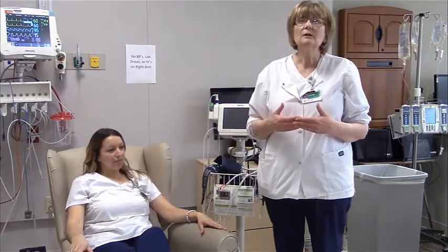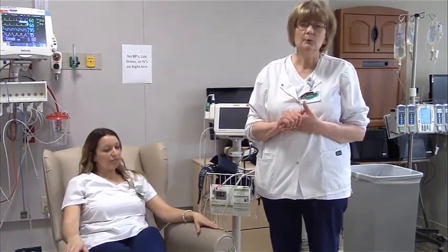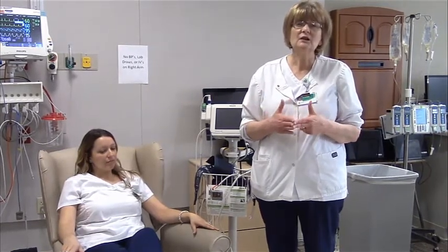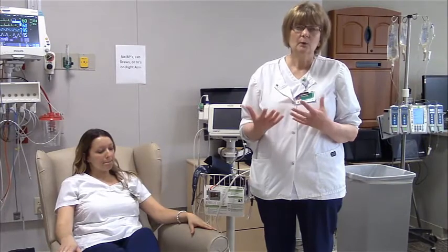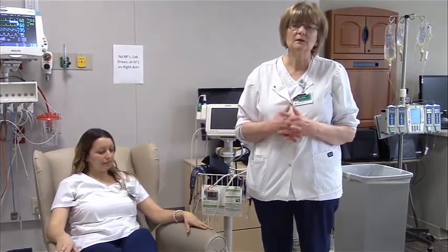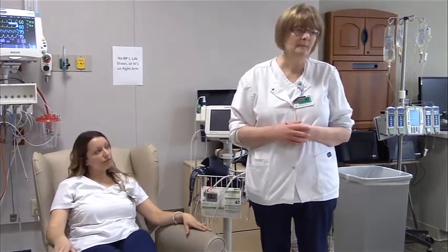Now, when you are doing a rectal temperature, you will have to make sure you lubricate the probe before you insert. It should be a gentle glide about an inch into the rectum, and then it will record your temperature. If you meet resistance, stop what you're doing and alert the nurse to the fact that you cannot obtain it and the reason why. Alright, so we will be showing the oral temperature for you.